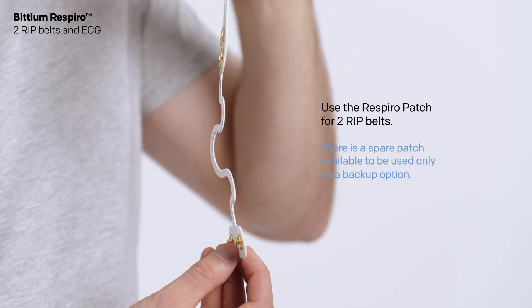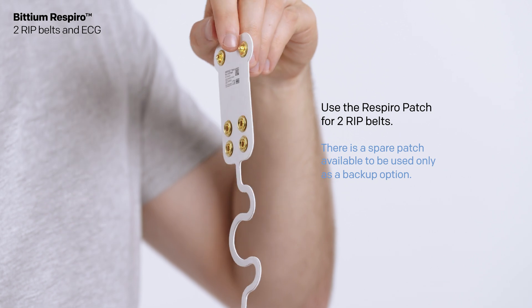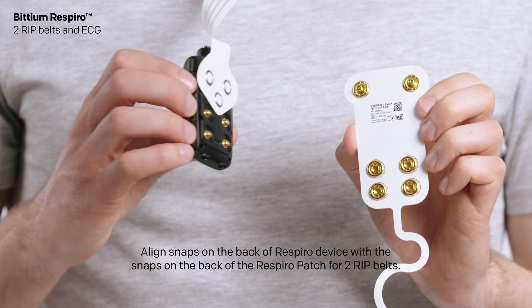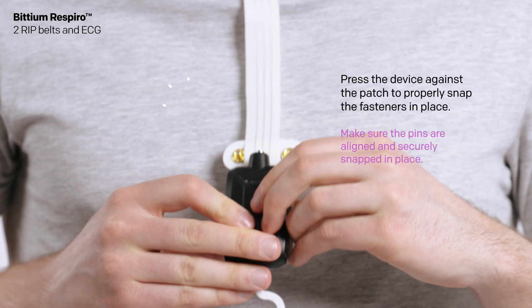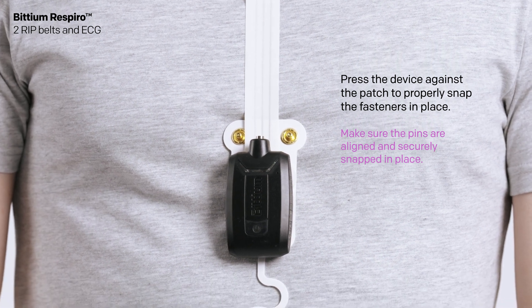Use the Respiro patch for two RIP belts. There is a spare patch available to be used only as a backup option. Align the snaps on the back of the Respiro device with the snaps on the back of the Respiro patch for two RIP belts. Press the device against the patch to properly snap the fasteners in place.